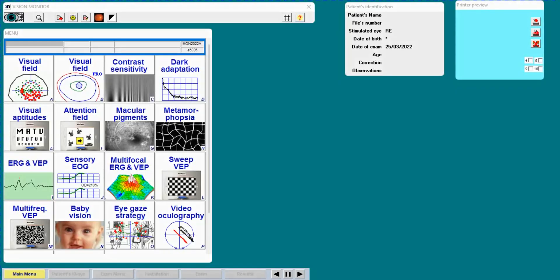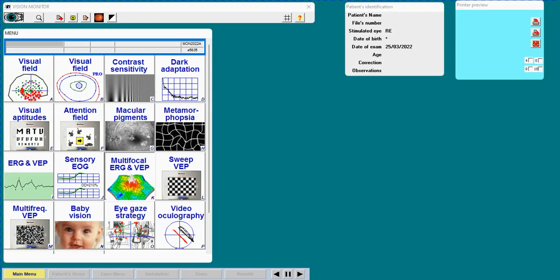Before I install the patient, let us take a brief look at the interface. Here is the list of exams we can perform on this machine. I will select the multifocal ERG exam.